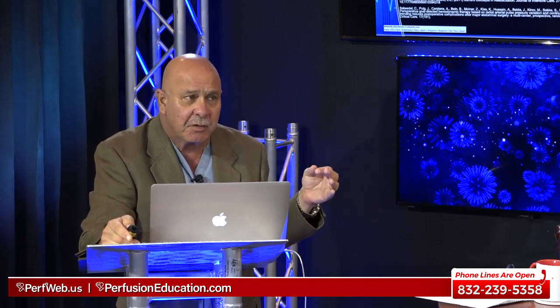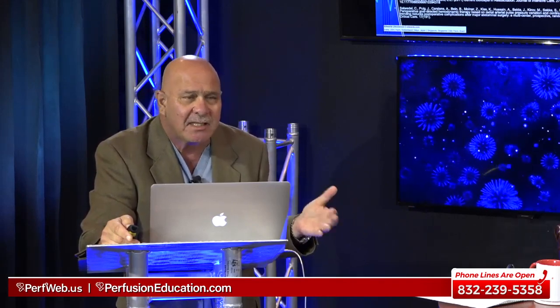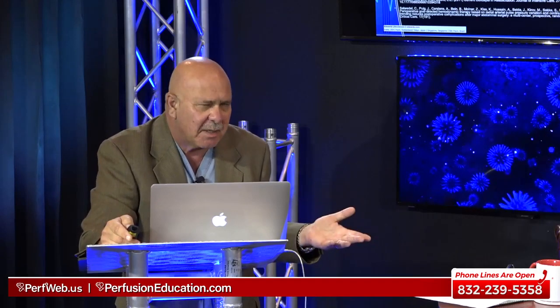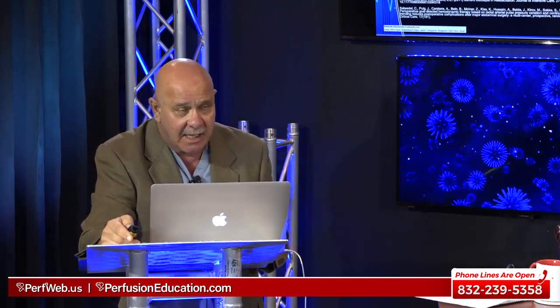Now, where it gets a little tricky is that because you're only doing VV ECMO, you're not in the arterial system. It may be an issue if you're measuring central venous saturation or CVP, which really has limited value. On VV ECMO, that number's not going to help you a lot, but it is going to tell you what your stroke volume variation is, because that is based on your arterial waveform. Pulse pressure variation, systolic pressure variation, those parameters are going to stay intact even though you are on VV ECMO. So I think this device would be very useful in that setting, yes.